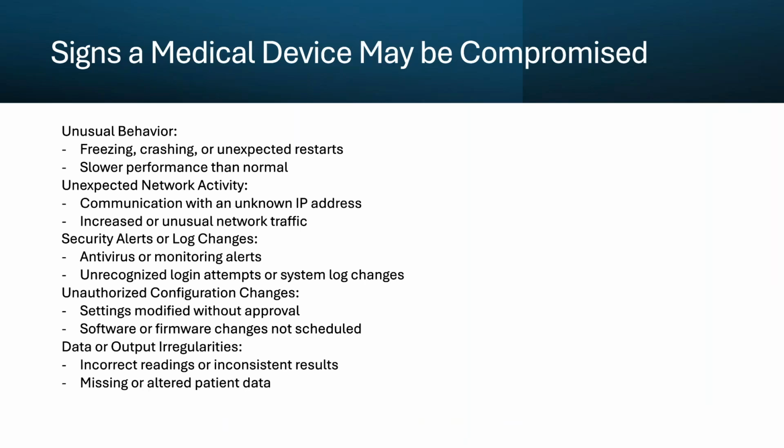Unauthorized configuration changes should always raise concerns. If device settings have been modified without proper approval or software or firmware updates appear that have not been scheduled, investigate immediately. Maintain change control documentation so you know what changes are authorized.